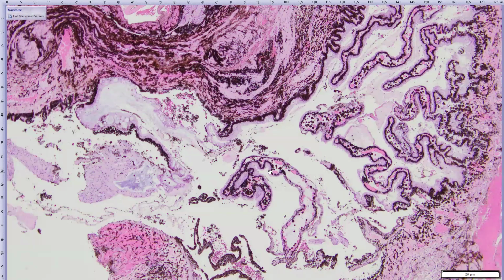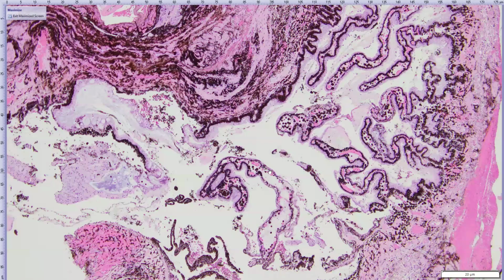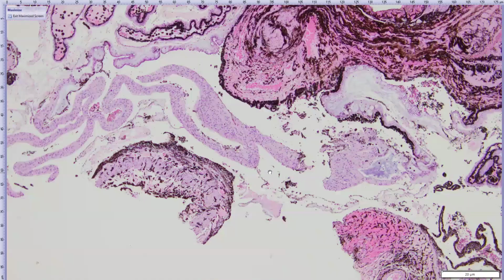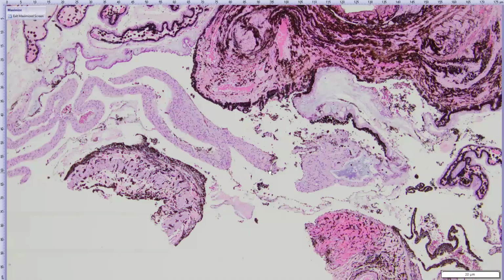But with their clinical history of bilateral retinal degeneration and then cataract formation, which can often occur later in the disease for PRA, it is suspicious that there's maybe both primary retinal disease and maybe glaucomatous changes occurring at the same time in this retina, which is something that we discuss in our morphologic diagnoses and our comments.